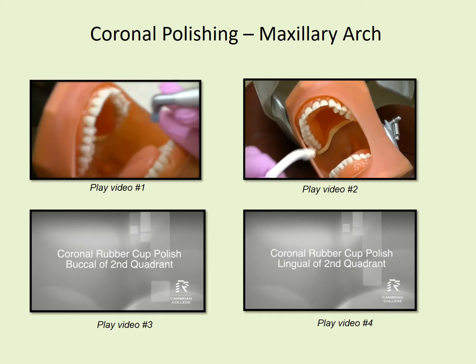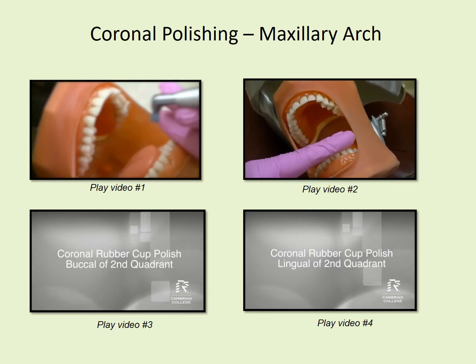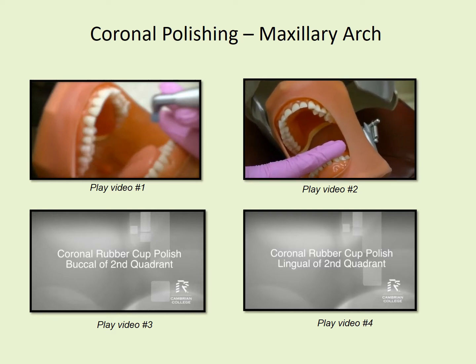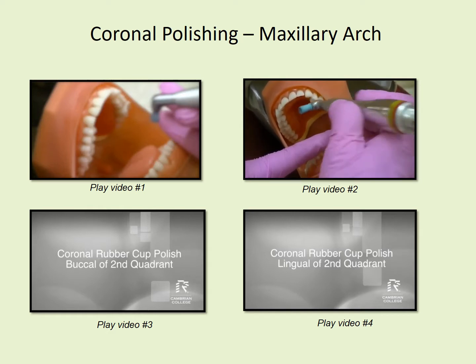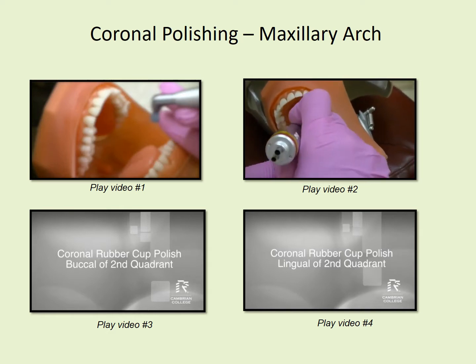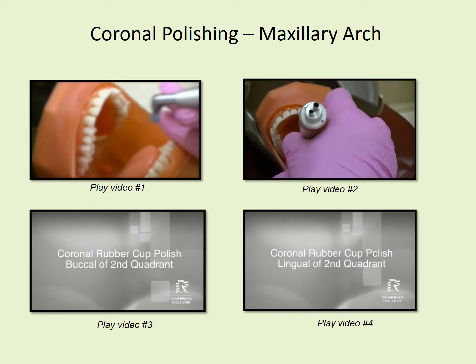Okay, so lingual of the first quadrant: saliva ejector, prophy paste in your cup. Turn your saliva ejector off. With your non-dominant hand, go across the lower anteriors, so that you can build your fulcrum up with your dominant hand and better access the lingual.